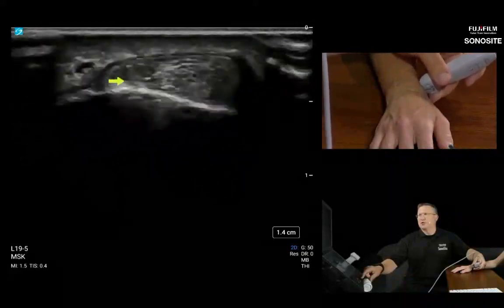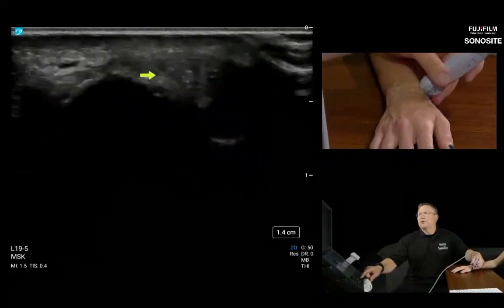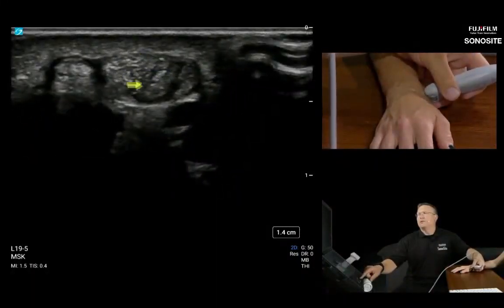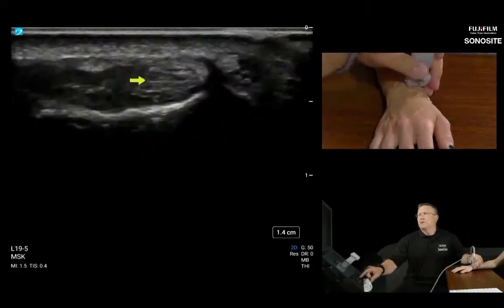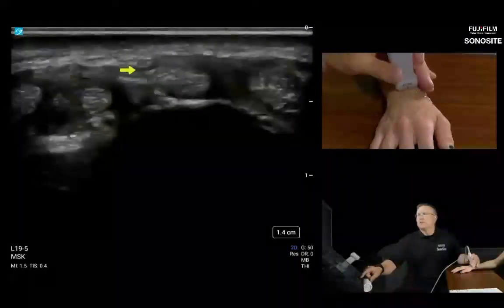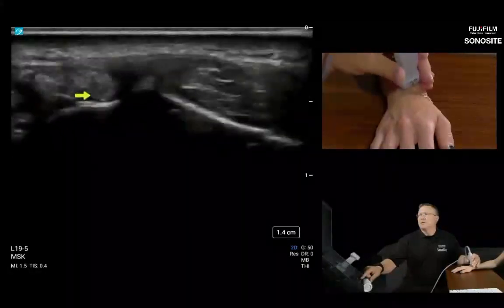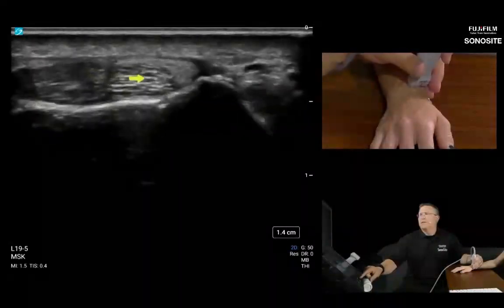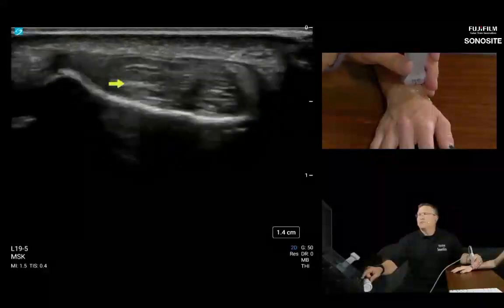Brevises tend to be shorter. Longuses tend to be longer, as we talked about in the PowerPoint. So remember how to remember it from the PowerPoint. We have longus, brevis, longus, brevis, over Lister's tubercle, longus again. So here we are at EPL, and then this is ECRL and ECRB.